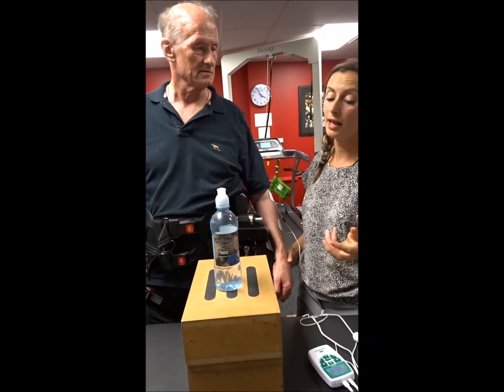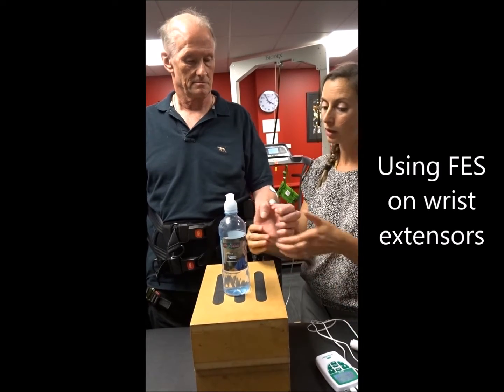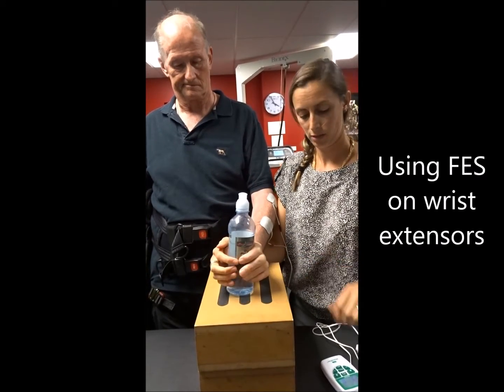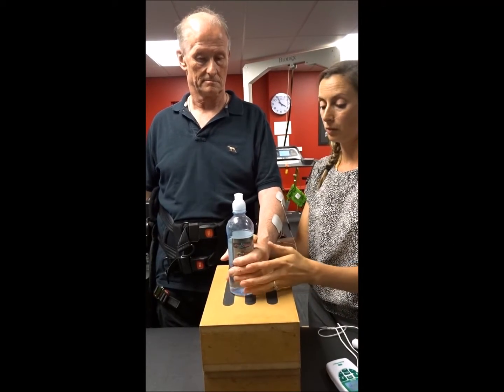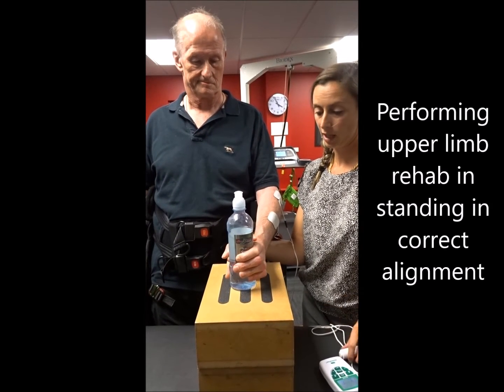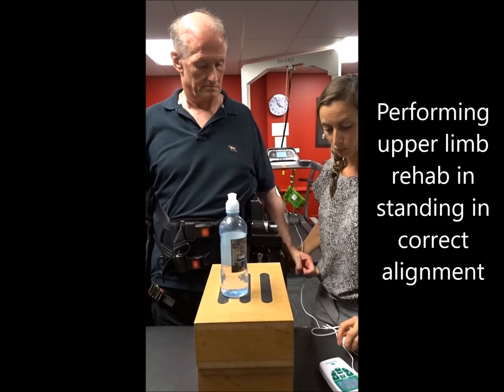And start the hand. The hand is going to lead your arm. So reaching for the bottle. Lovely pick up. Reaching right out. And now lift up. Good. Place back down. And try and release. And arm back down by your side. Beautiful.